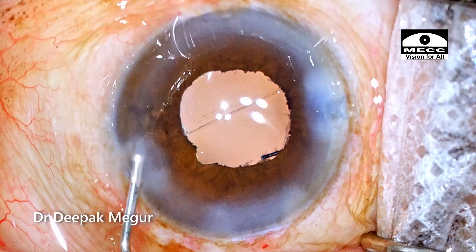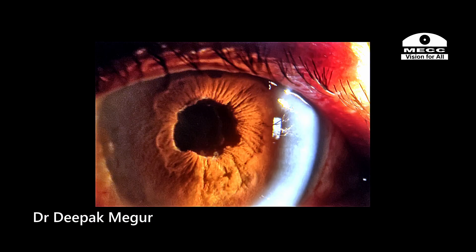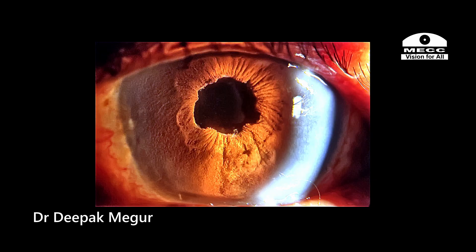The side port and the main incision is hydrated and the case is done. These are the first day post-op pictures. During stretch pupilloplasty, if we tear the sphincter, you can have an irregular pupil — particularly in a dark brown Indian iris.